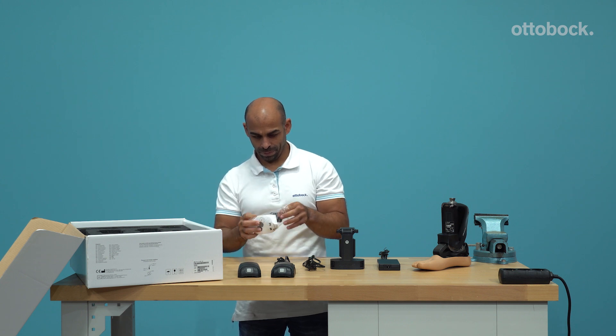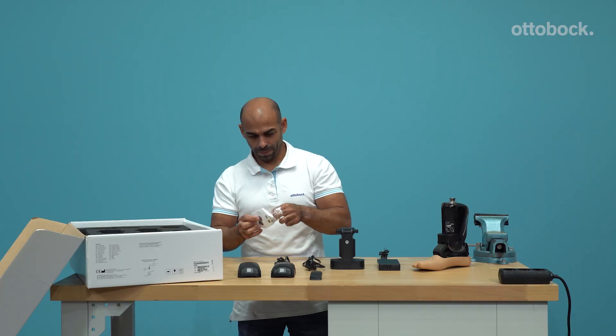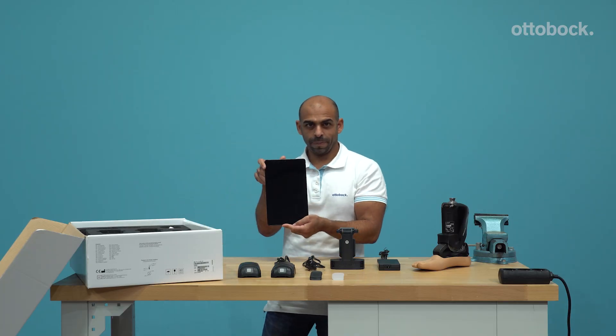The gray heel wedge of medium stiffness is already pre-assembled in the prosthetic foot. Alternatively, the black or transparent heel wedge can be inserted in the foot. The black wedge has the firmest durometer and the transparent wedge is the softest.